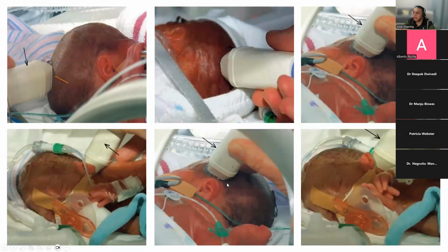Gel is a very important interface. It needs to be relatively uniform. A simple example I'd like to give you, by showing you this last image, is that if you press too hard, it squeezes gel out. You have more gel on this interface and less gel on this interface. So how will that affect your image? Naturally, you have a better gel interface over here, and you are trying to look at the anterior part of the ventricular system.